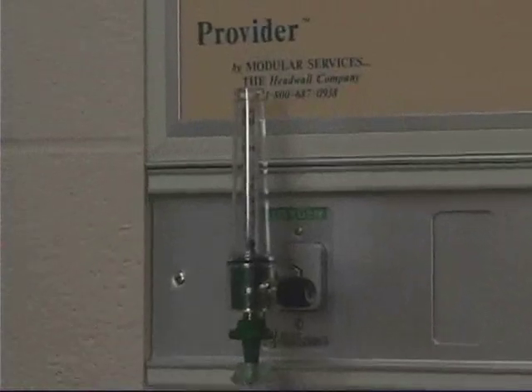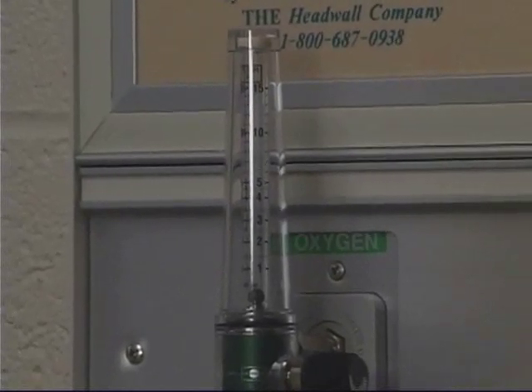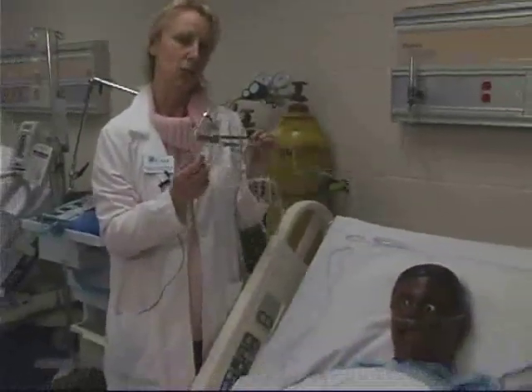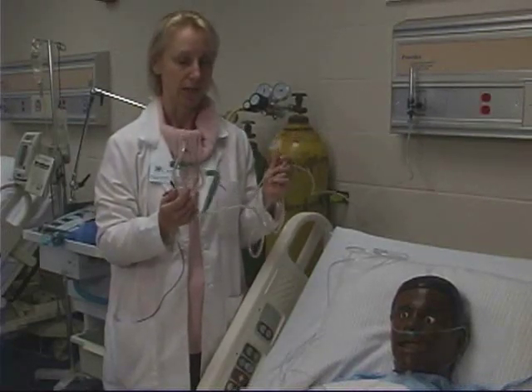You're going to need to set this between 8 and 12 — that's pretty high. The reason you need a high flow of oxygen through the simple face mask is that as the patient exhales, the exhaled air is partially contained inside this face mask. Not all of it will go out through the ports, and that exhaled air contains a high amount of carbon dioxide. So you need a high flow of oxygen to help push out the carbon dioxide through these ports so the patient isn't re-breathing it. This face mask can deliver between 35% and 65% oxygen, depending on the setting between 8 and 12 liters per minute.